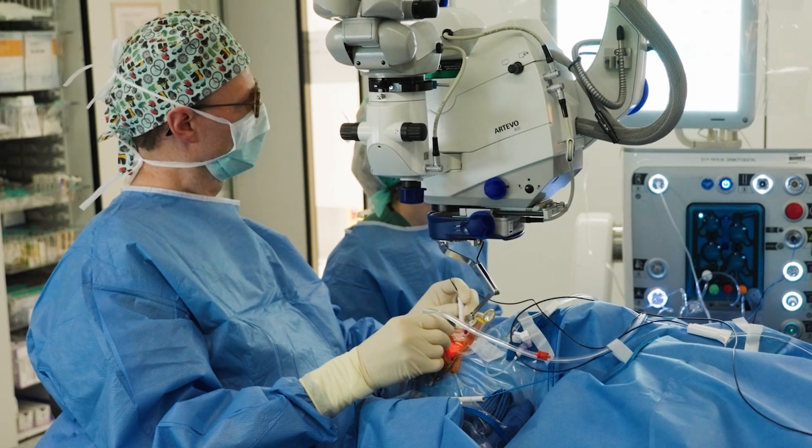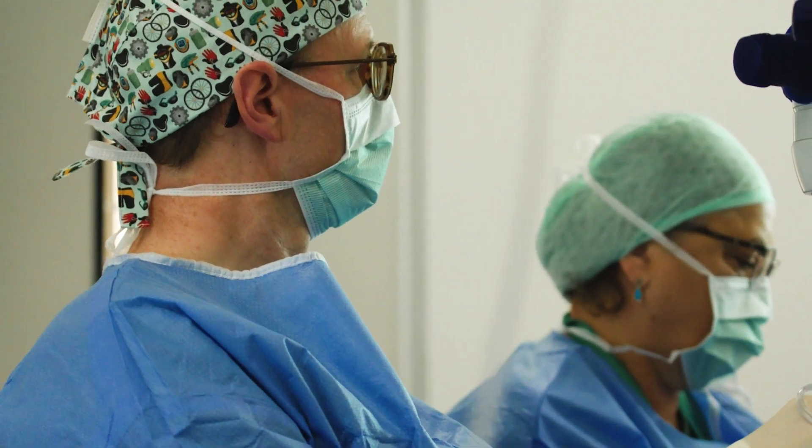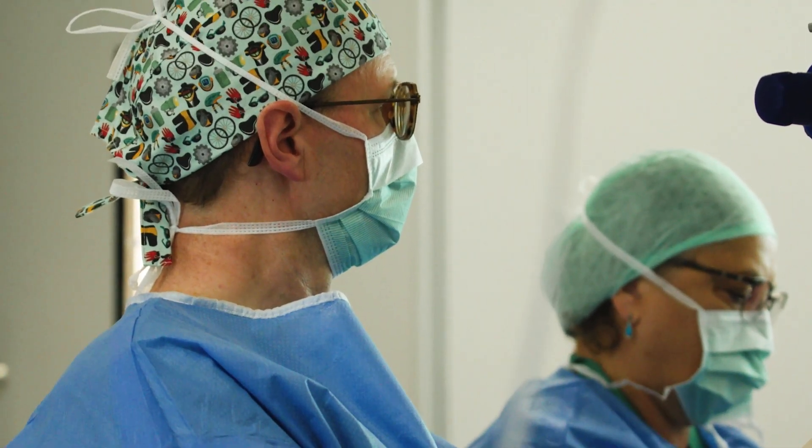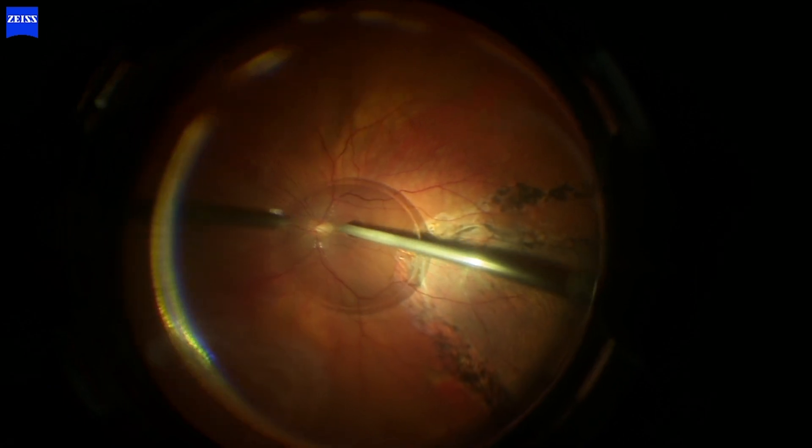I can do a vitrectomy without the need to indent, and that's really something new on the market. Not only does it speed up your surgery because you can skip indenting, but it's also a lot safer for the eye. Moreover, the perfect image quality you see every time you use the disposable lenses — for me, it's invaluable.